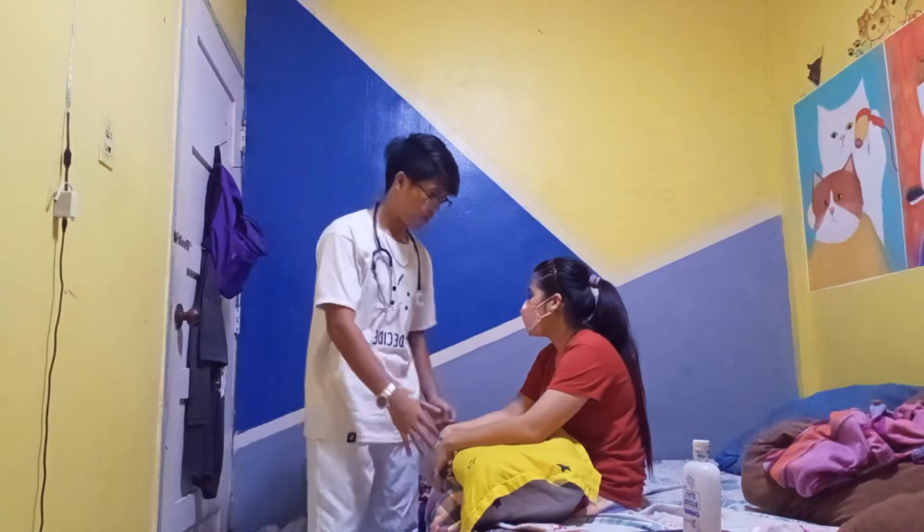So next is assist client in supine or sitting position to provide easy access to axilla.